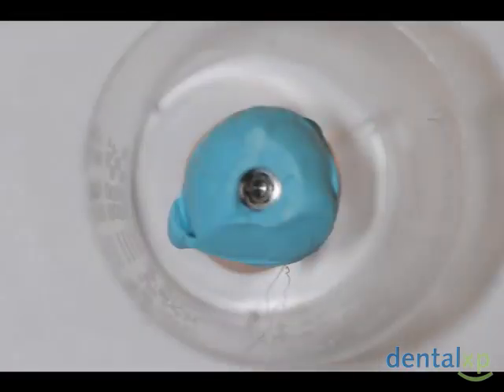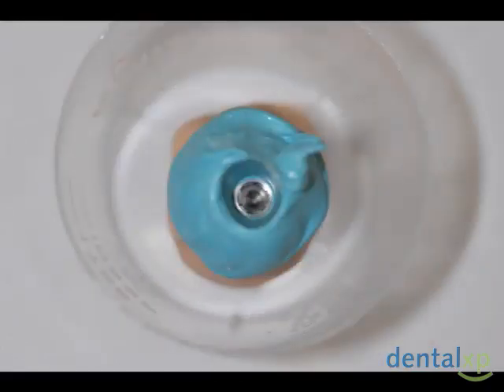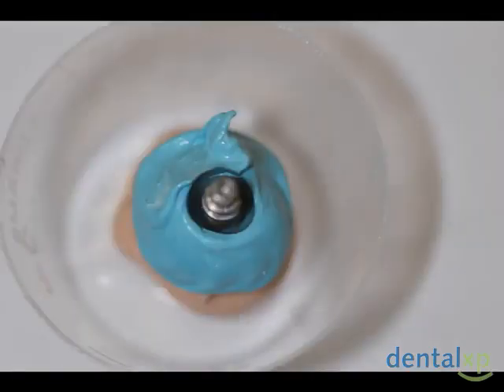Here is the emergence profile that will be developed from a normal, uncontoured healing abutment. Here is the emergence profile that will be developed from a contoured healing abutment. This shows the difference in space between a normal healing abutment and a customized healing abutment that then will allow the proper emergence profile.